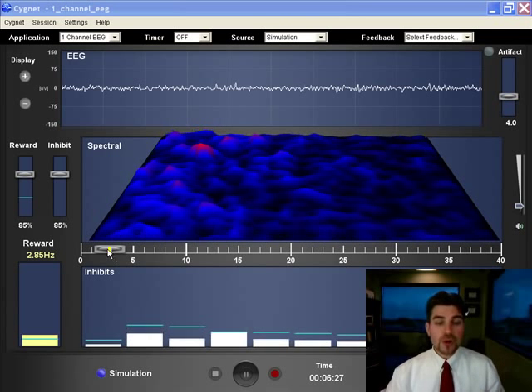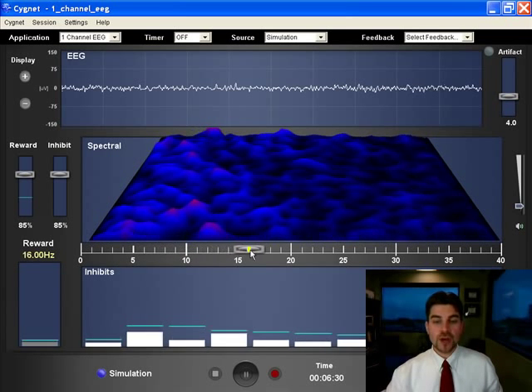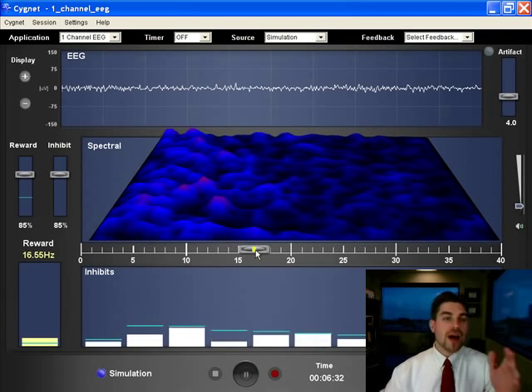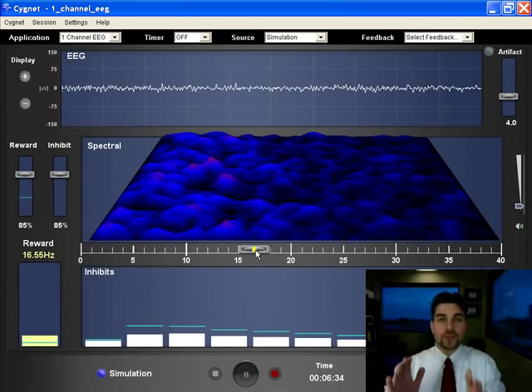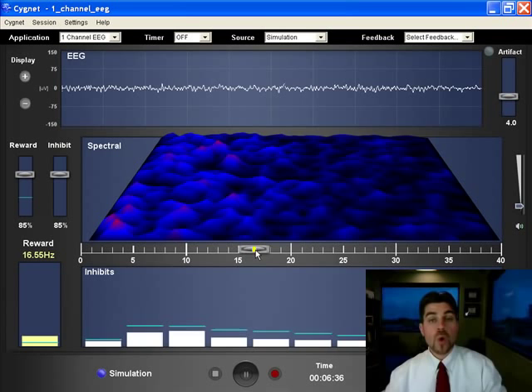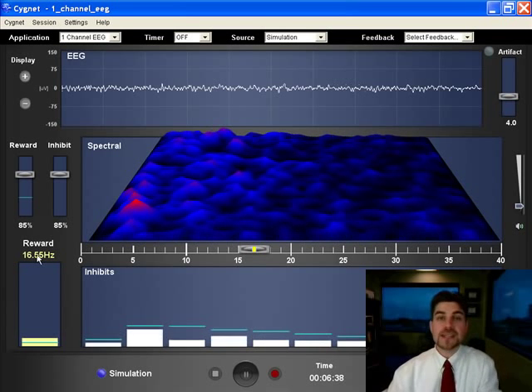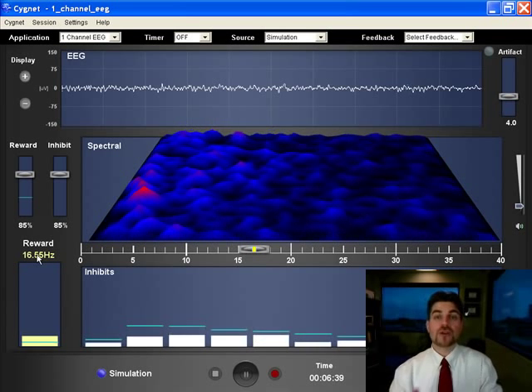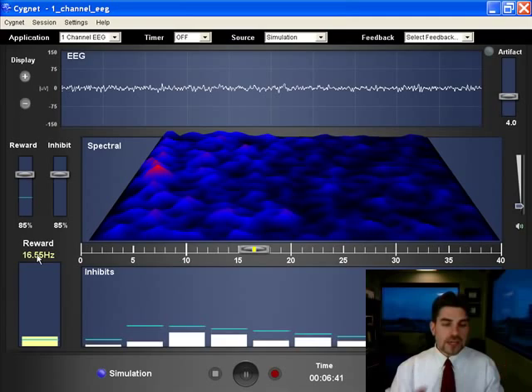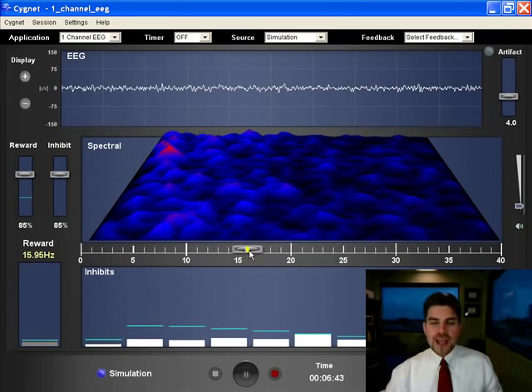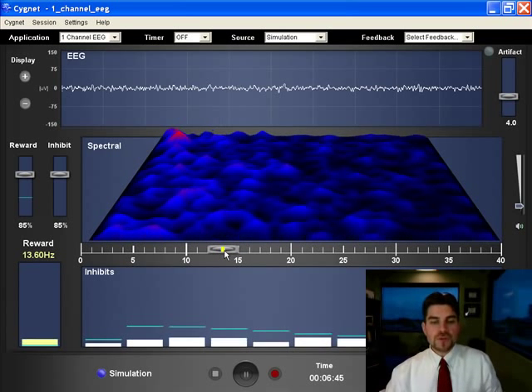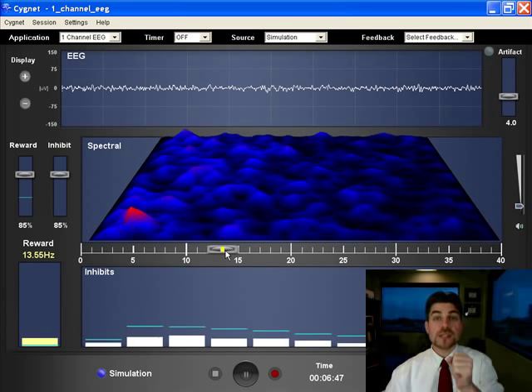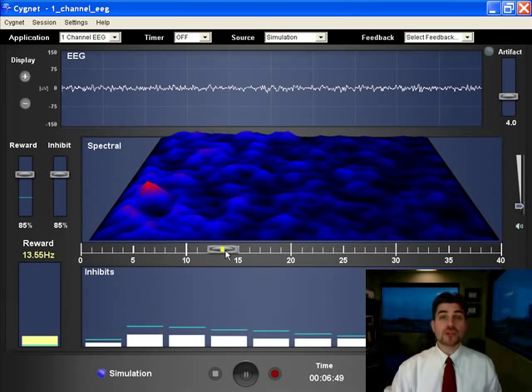For example, we put this simple reward slider on the screen. We're no longer talking about high and low of that reward band. We're now just talking about one number. Over here you see 16.5 describes the middle of that filter. So easier numbering, easy slider that allows us to just move that around and adjust the reward frequency on the fly and very simply.